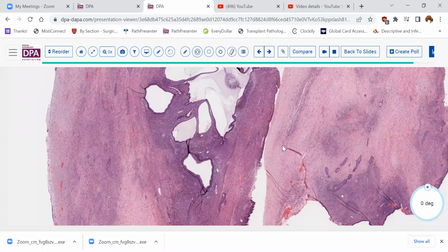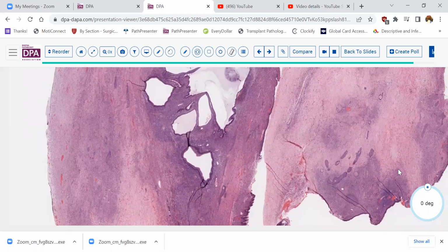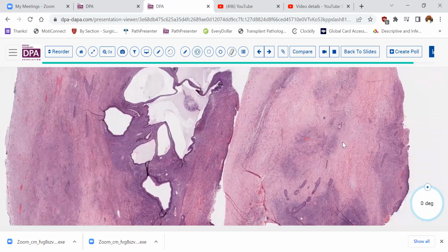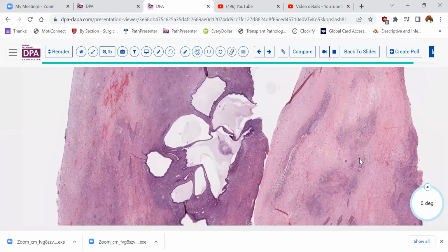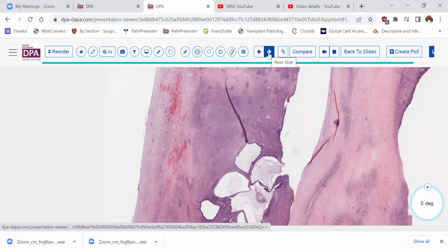However, once you have that level of aggressive growth, it may obliterate the Brenner tumor. The other feature to remember here is, of course, that Brenner tumors tend to be fairly small and therefore could be missed on sampling if you weren't really thorough, or they were very small. In this case, as you can see, there was quite a lot of the Brenner tumor. I think about a third of our blocks contain some element of the Brenner tumor. So a very interesting little combination of lesions.